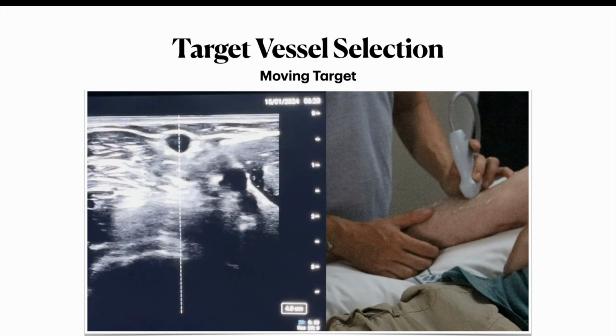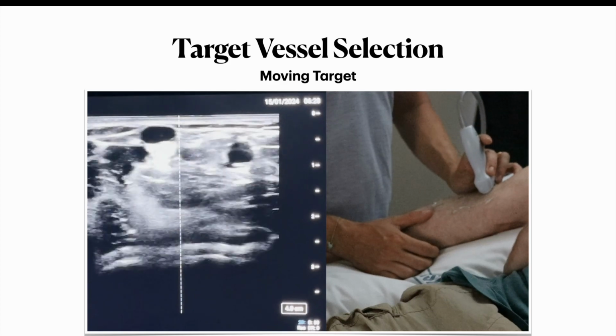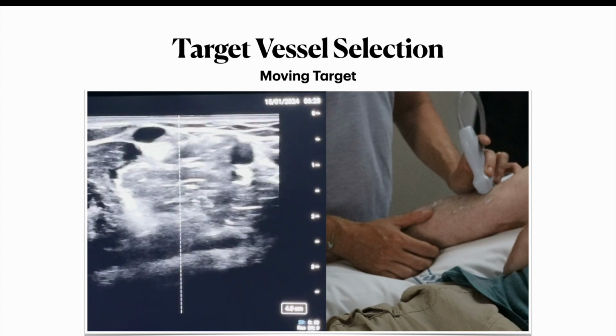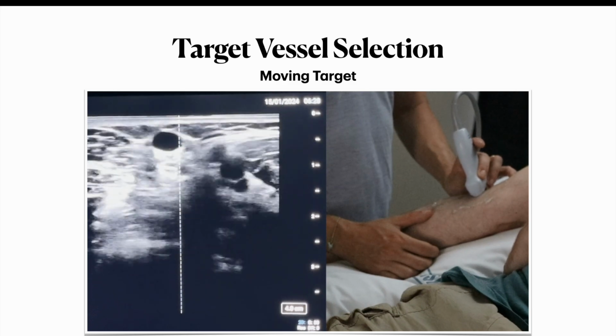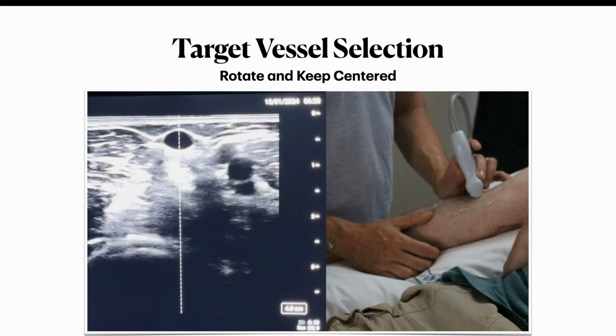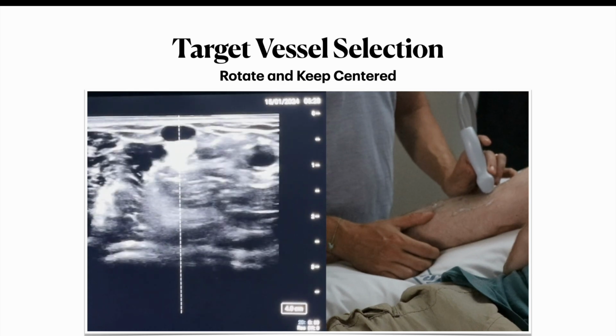What we can see here is that as the ultrasound probe is sliding proximally, the vessel on the screen will move to the left. In order to keep the vessel in the center of the screen so that we know that the needle insertion will go in the same trajectory as the vessel, we'll have to rotate our ultrasound probe and then slide again to ensure that the vessel stays in the center of the screen.